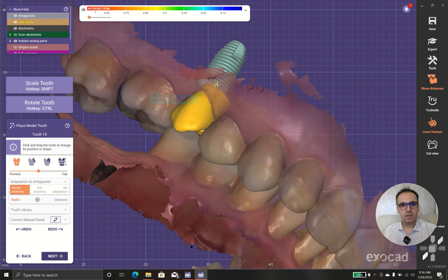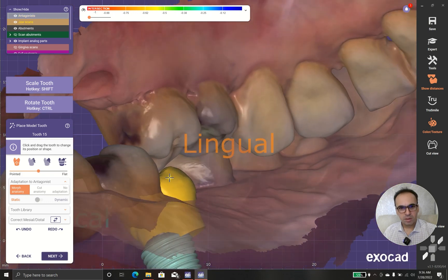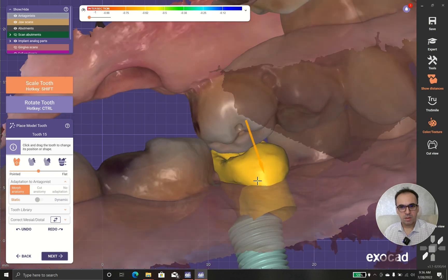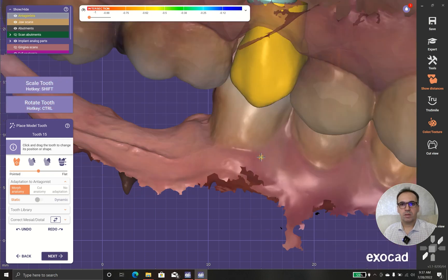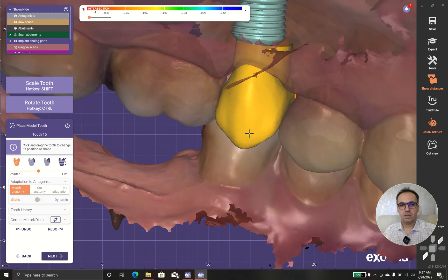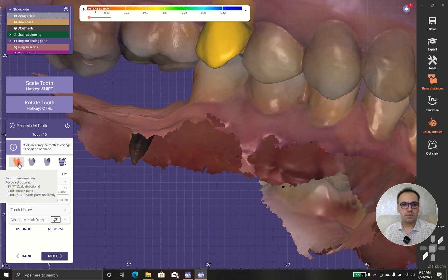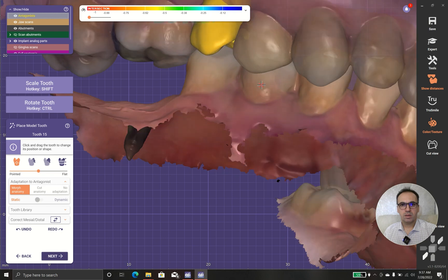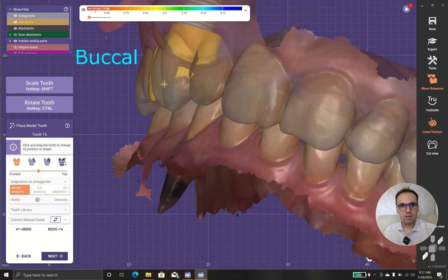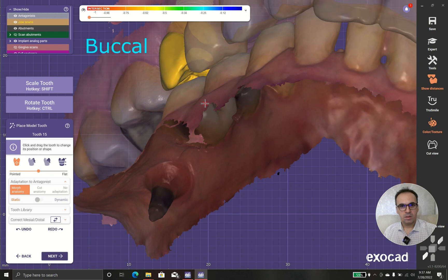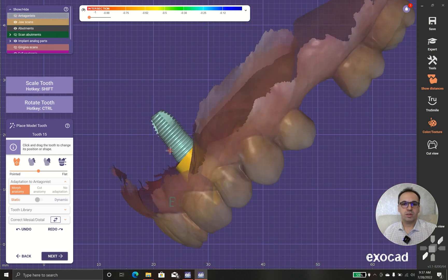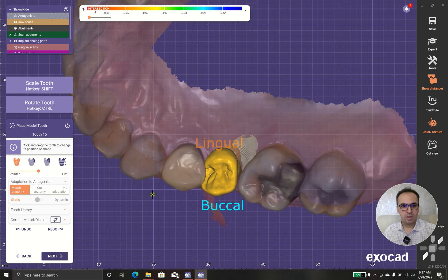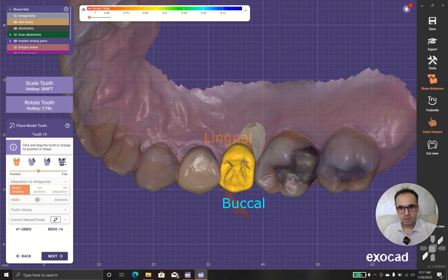Let's see what we have in Antagonist. I can choose Ctrl N. So what's wrong with this case? We have some kind of supereruption, so the lingual part is not in proper position.